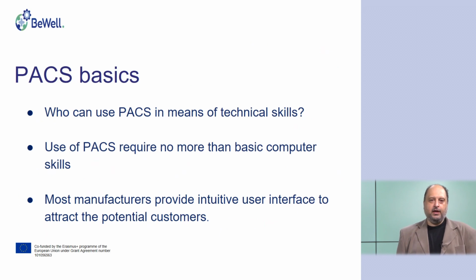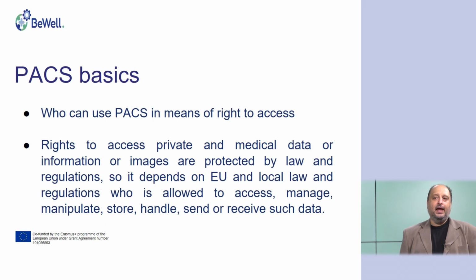Who can use PACS? And first of all, in meaning of technical skills, usually these systems require very basic computer skills, so they are not sophisticated. This is normal because most manufacturers make it user-friendly with a very intuitive interface. Otherwise, of course, the customers will consider some other software. So technically, they are very easy to use.